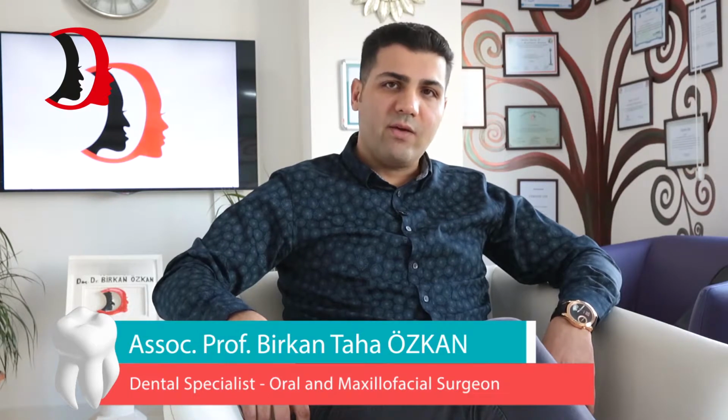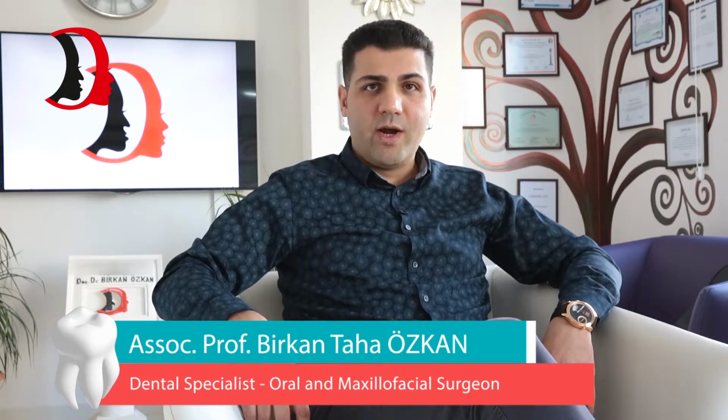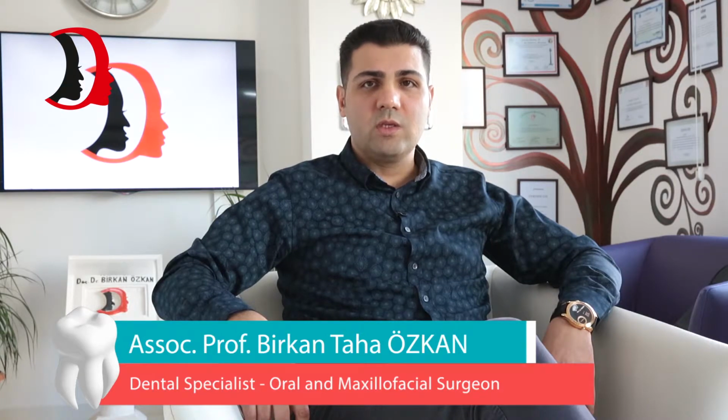Traditional implant operations require a gingival cut through a scalpel, which means a knife. Right after that comes the elevation of the gingiva and exposing of the bone, which then starts bleeding normally. Subsequently, the implant region is prepared with drills and the implant is inserted, which takes a longer time.